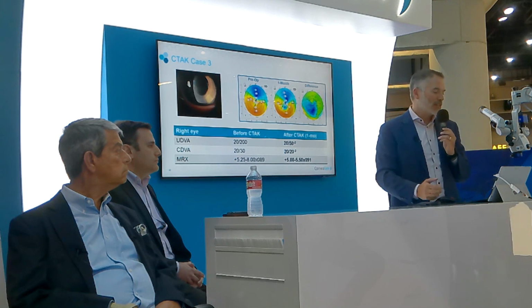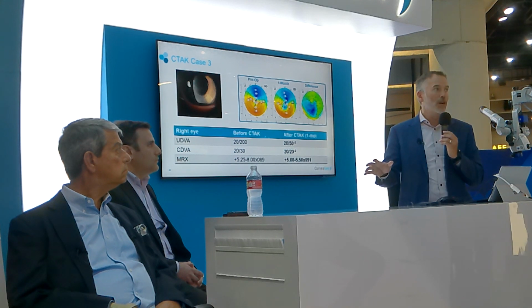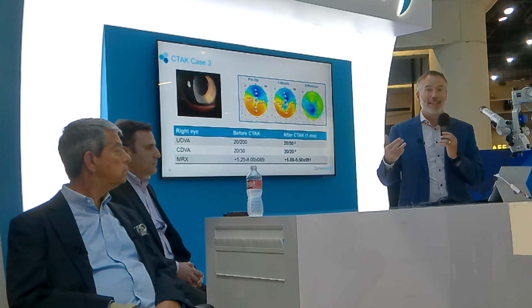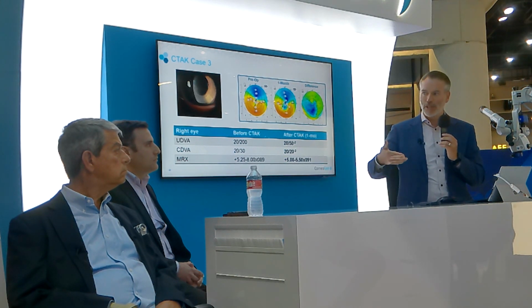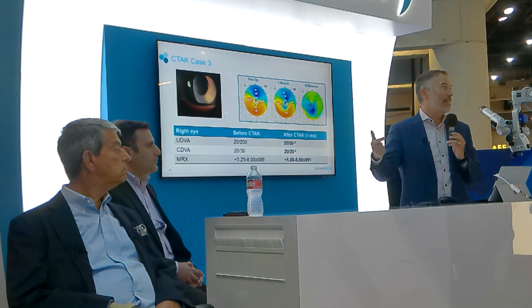And the other thing that I'll share, and I don't have as much experience as these guys do, but I've done it. And I thought that it was going to be a really difficult surgical procedure to do. And it's not. You're taking this surprisingly rigid corneal segment, putting it in, and it's extraordinarily satisfying, and even more satisfying because the next day they're already seeing better.